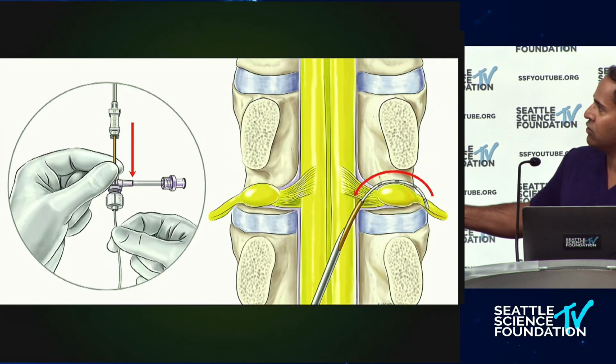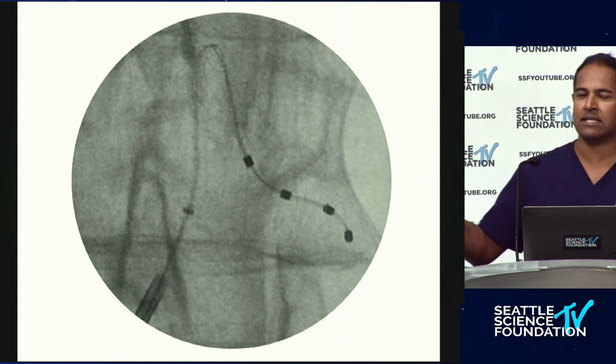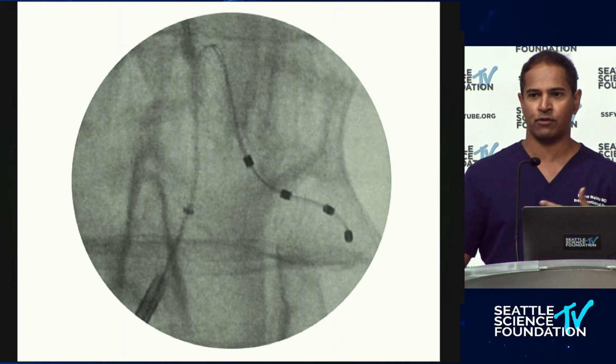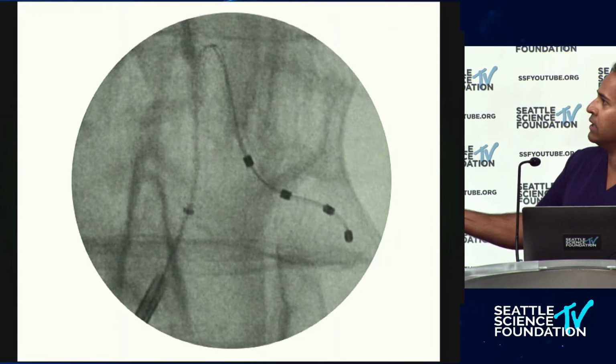They take the passenger to its location, drop off the passenger, which is the lead, and retract the sheath, okay? Now the fun part, making the tension relief loops. This is basically the anchoring aspect of this procedure, as opposed to actually putting an anchor in sutures as you would with dorsal column leads.